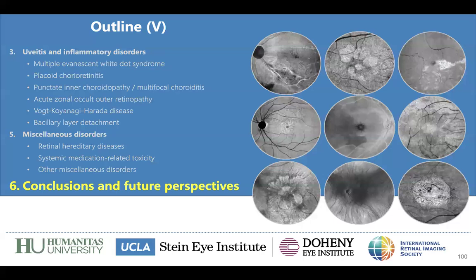I remember there was a meeting here in which we were attending a course, and they had a Dream OCT. Of course, it was a really short experience, but I think the segmentation algorithm is a little bit different.